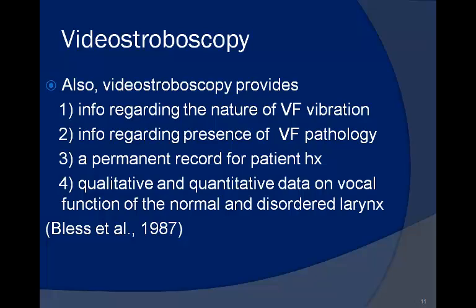Video stroboscopy provides us with information regarding normal vocal fold vibratory characteristics, vocal fold pathology, and the resultant effects of the voice pathology on vocal fold vibration. This information helps us to develop and tailor our therapy plan specifically for a given patient. Video stroboscopy also provides a permanent record for pre- and post-therapy comparisons. I frequently recommend that professional voice users, such as singers and actors, obtain a video stroboscopic exam when they're vocally healthy as a record for comparison if or when they ever develop vocal problems.